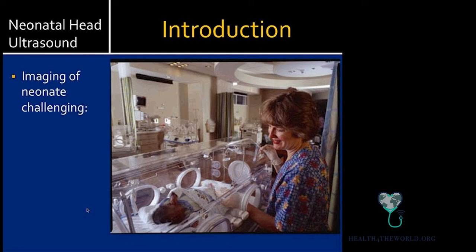As you may know, imaging of the neonatal brain has been quite challenging for a number of reasons. For babies, it's very difficult, particularly without any sedation. Often they're very critically ill, so it can be challenging to perform examinations or take them to MRI or CT because they're so ill. You can't transport them outside of the NICU. And there are considerations of radiation, so you don't want to do repeated imaging with ionizing radiation. If you get a non-radiation exam that can be done portably and can accommodate for motion, that would be ideal.